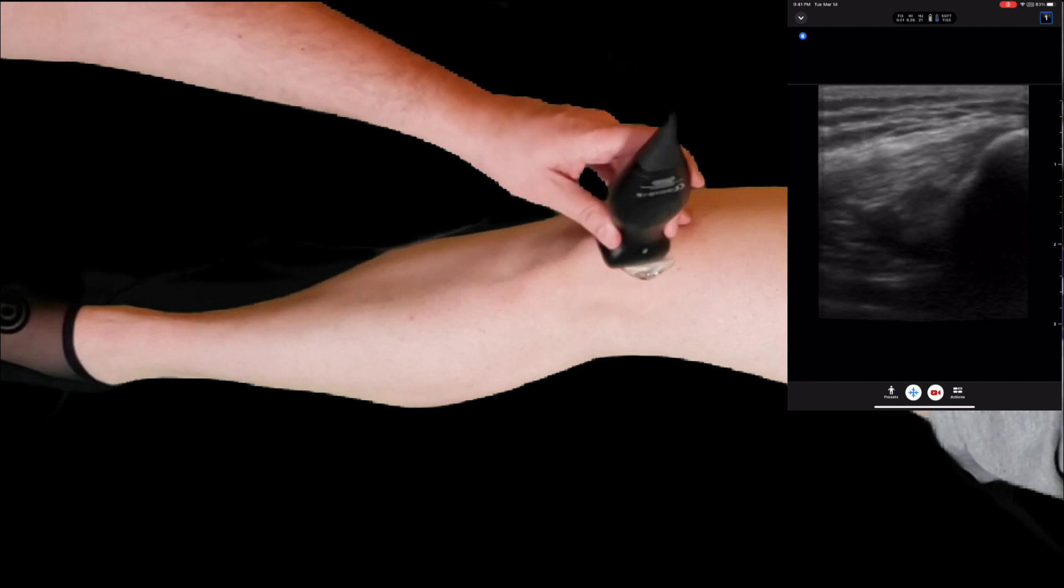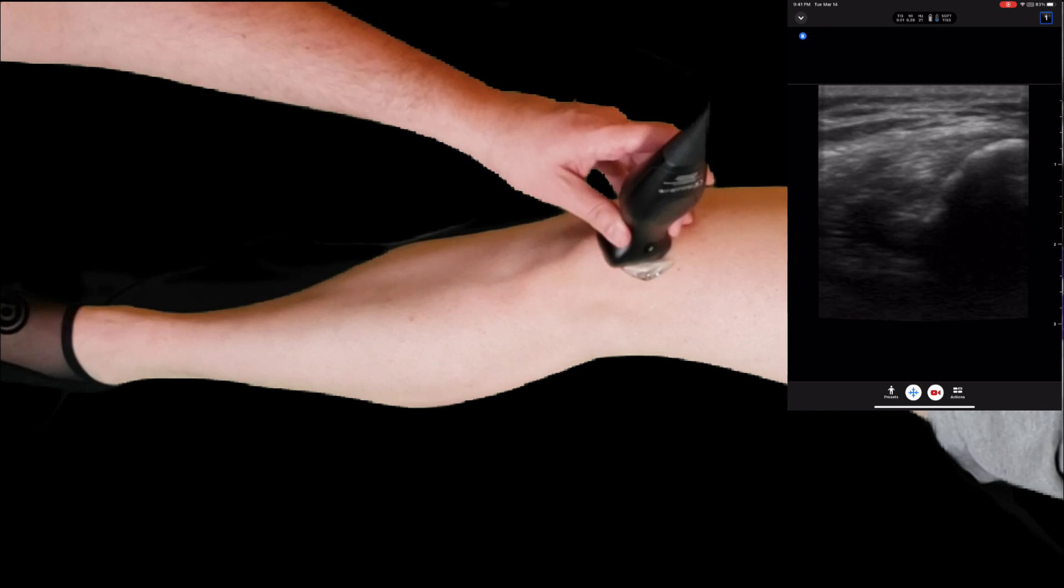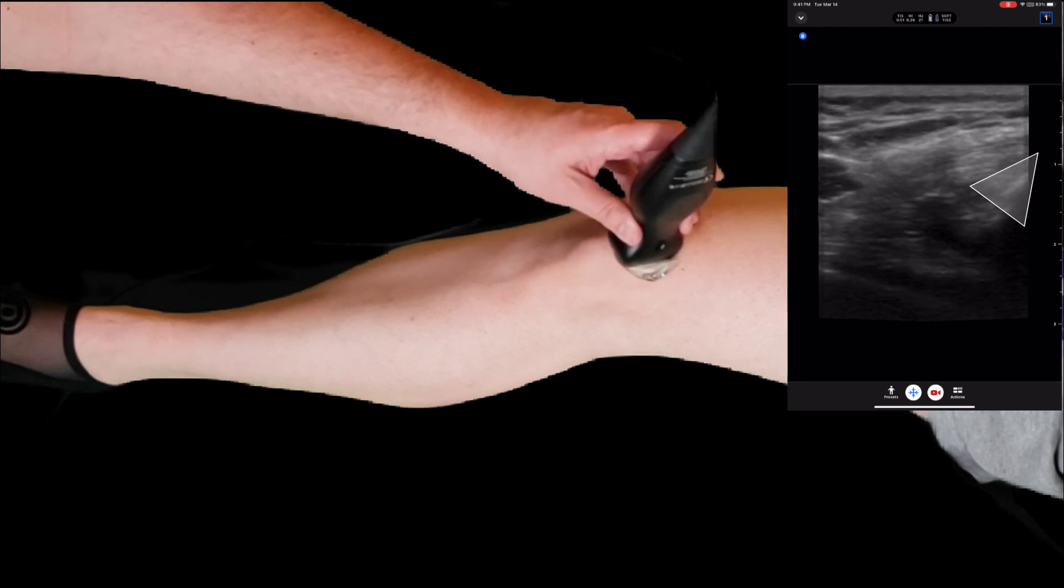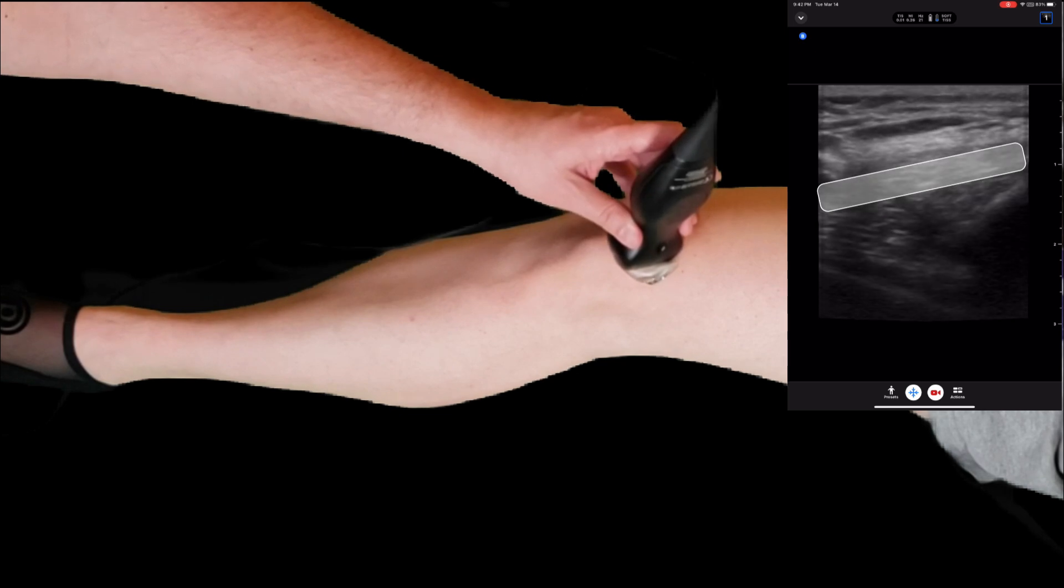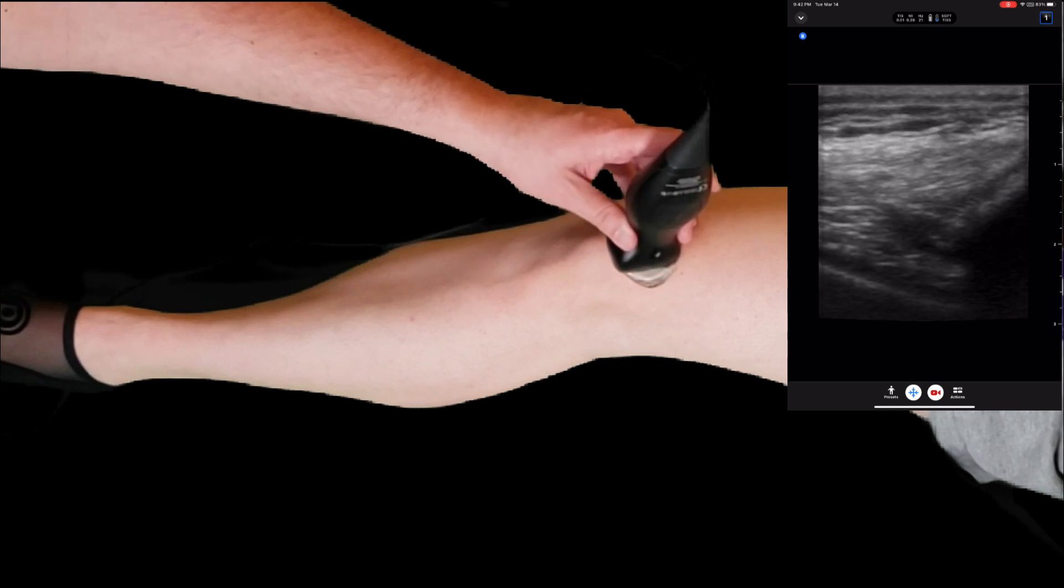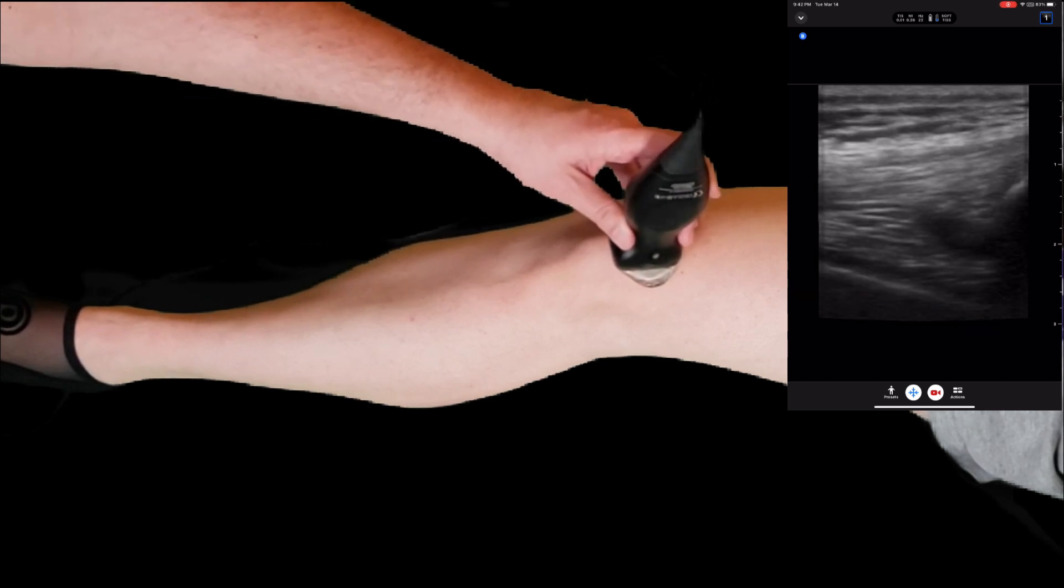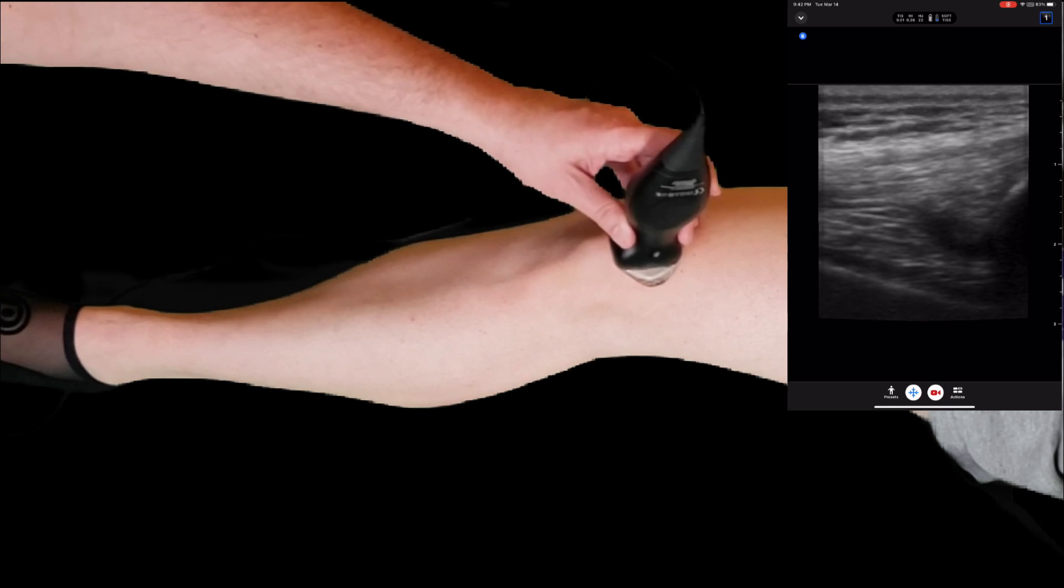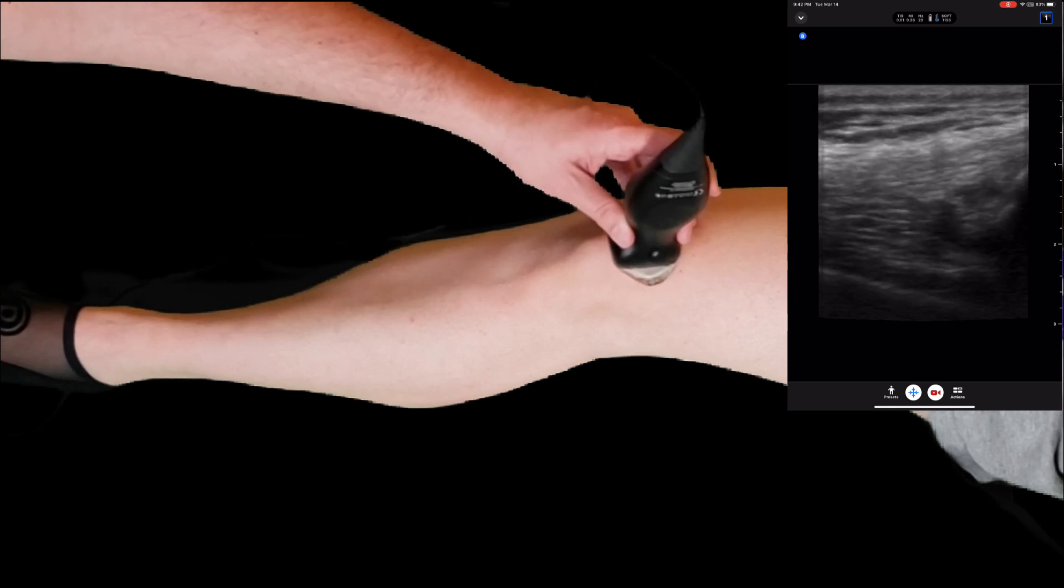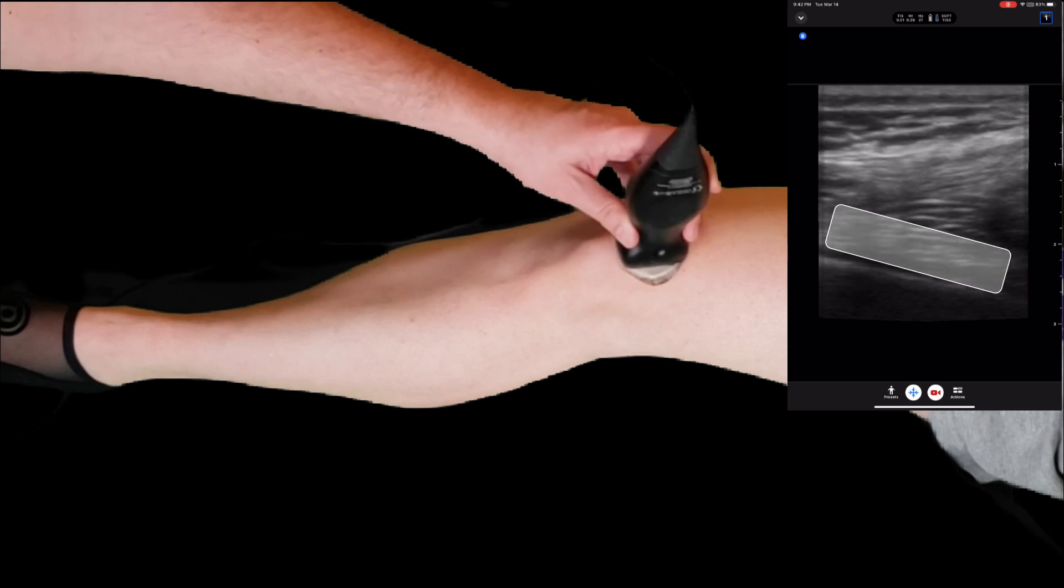We want to get a small amount of the patella in view, as well as the quadriceps tendon, the femur, the quadriceps fat pad, and the pre-femoral fat pad.